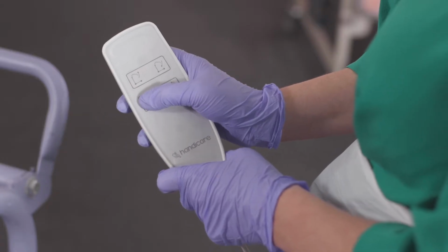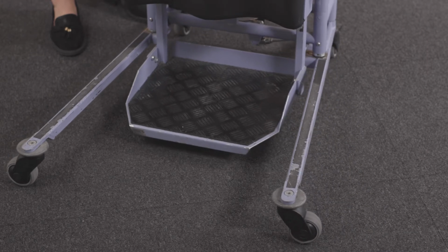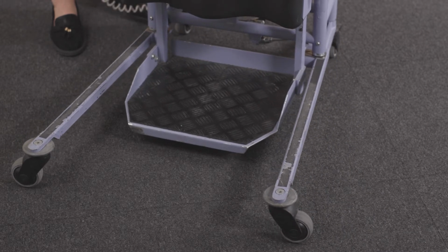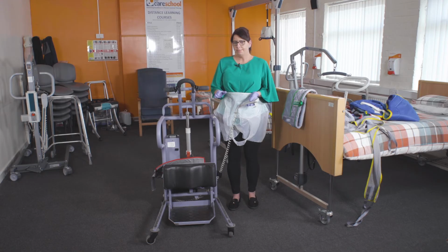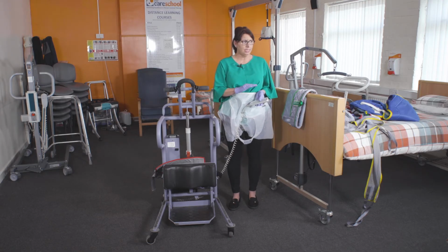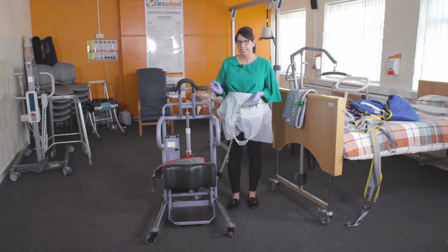The legs will adjust with the remote control. They'll go in and they will go out to help manoeuvre around obstacles. Again, same principle as the hoist, the brakes do not need to be placed on the standing aid.